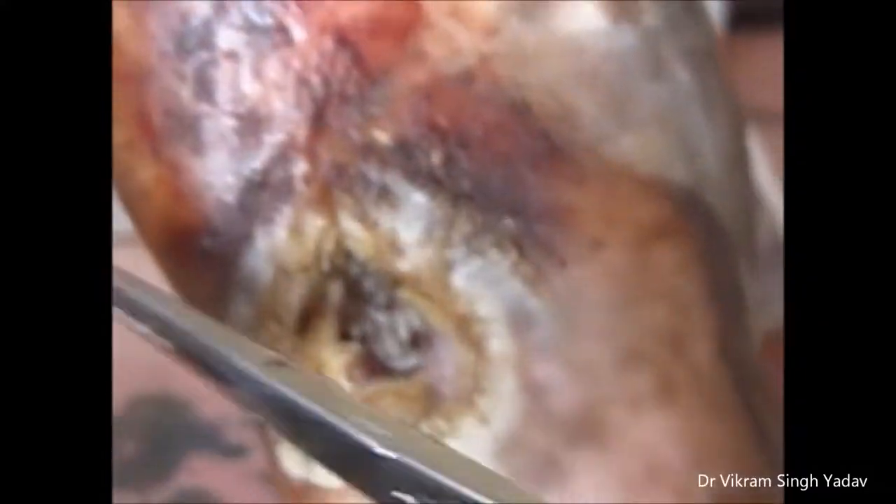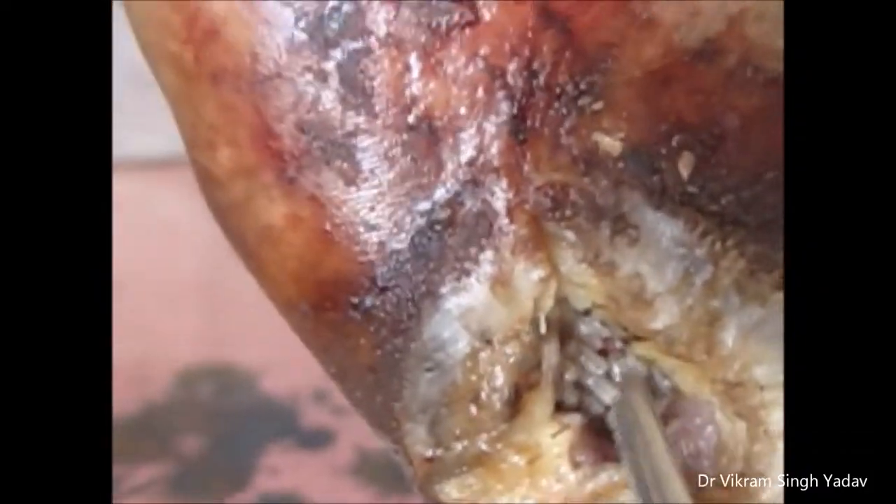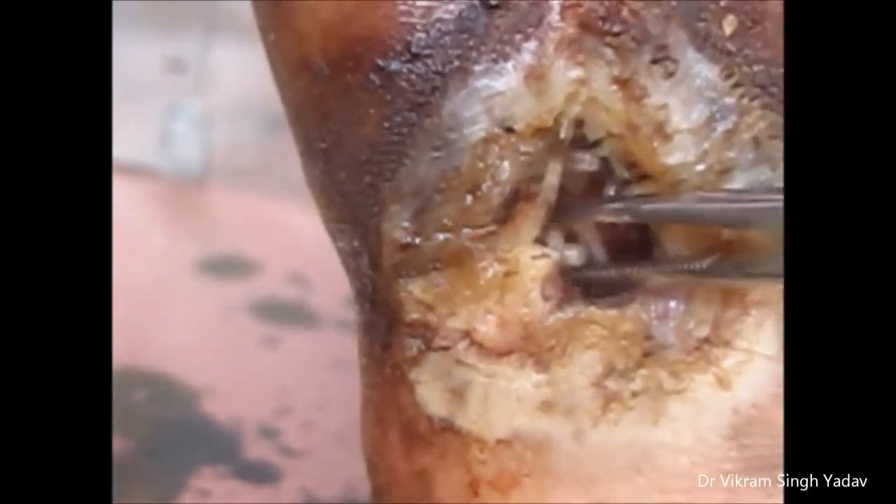Hi friends, in my previous video I explained how this wound was infested with maggots. Now I'm going to remove them manually with the help of artery forceps. You can see they just go inside when I'm trying to pick them. Slowly and manually I pick all of the maggots. Ideally, when you pick a maggot from inside a wound — this is a big wound.